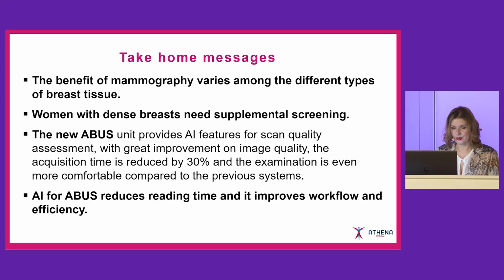So the take-home message is that mammography has been done a lot all these years, over the past 50 years. Many women, hundreds of thousands of women, have been saved, but we are at a point where we have recognized and acknowledged that mammography does not perform the same for all women. Therefore, women that have dense breasts have a lower sensitivity and supplemental screening is necessary.